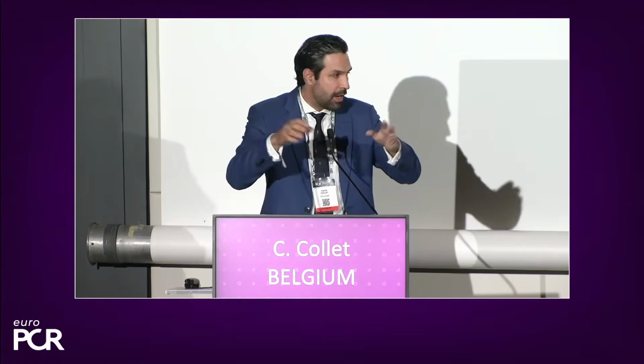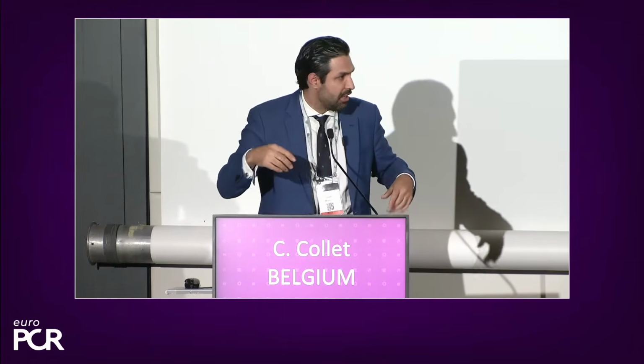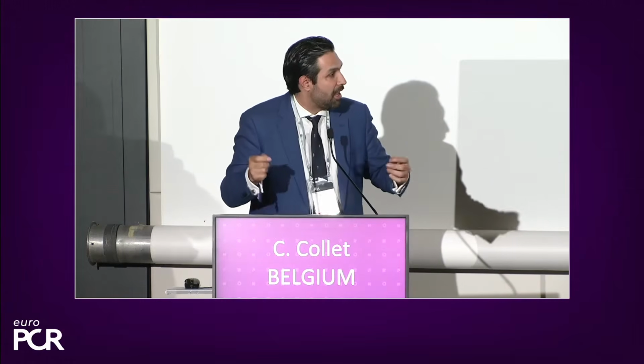So there are two tricks for radiation reduction here. One is collimation. So you have to collimate the space that you want to acquire. You don't have to do the whole acquisition with the field open. And the second, which I'm still not used to, Giulio, but I see in the cath lab next to me are the electrophysiologists, and they do a lot of these rotational things. And they go outside the room. Yeah. And they go outside the room, you see them all outside, saying, oh, they are doing the rotational thing. And for us, this has never been the case. But perhaps this could be one of the strategies to reduce radiation for the operator.